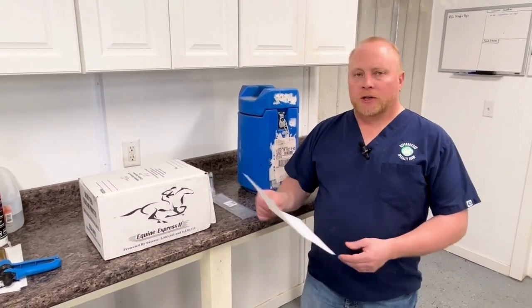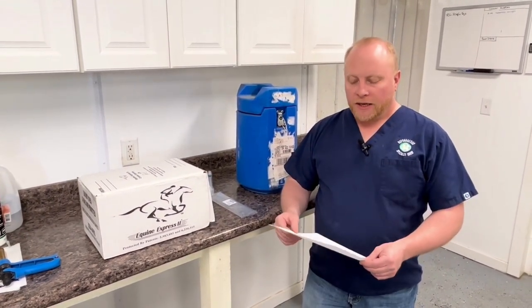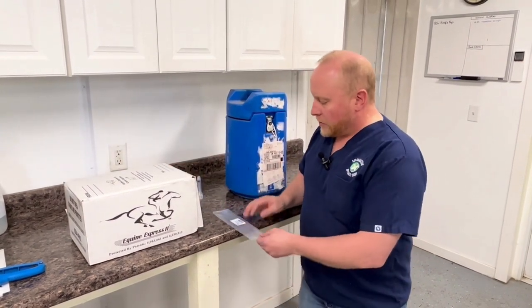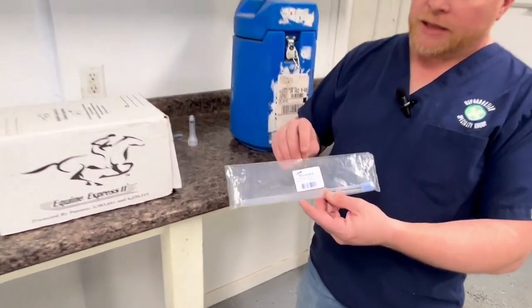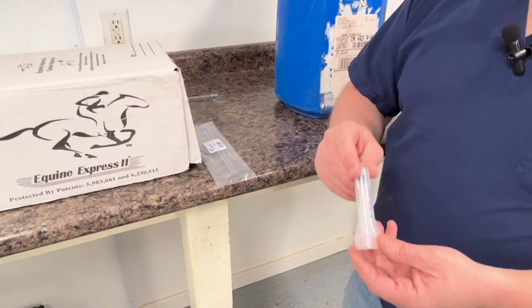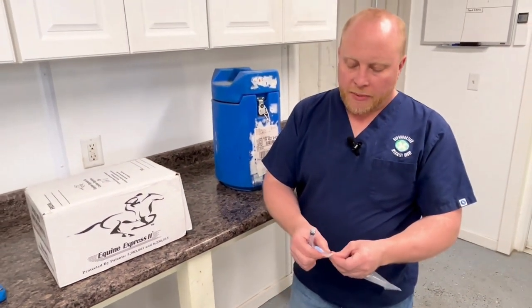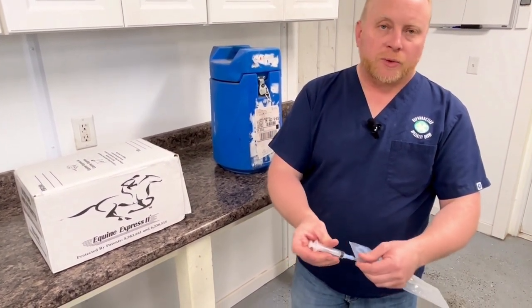When you get ready to start your splashing technique, you're going to have an information sheet such as this that will outline the details and the supplies you're going to need to make that successful. You're going to want to have your nine-inch pipettes — you'll see in a few minutes why we prefer that length. Then you'll need a nice new three or six mil syringe so it's clean and there's no risk of contamination. The pipettes will have rubber adapters that allow the syringe to attach well to them.